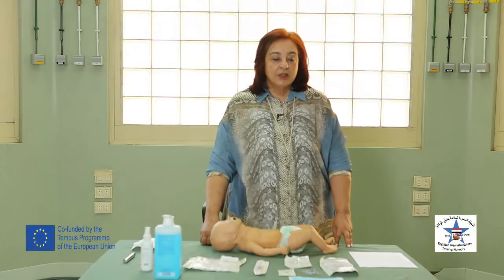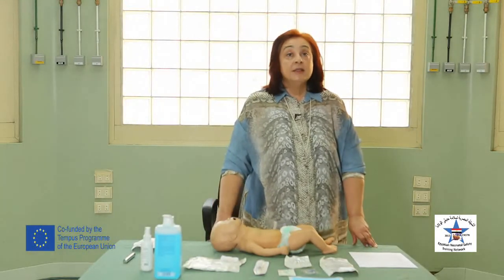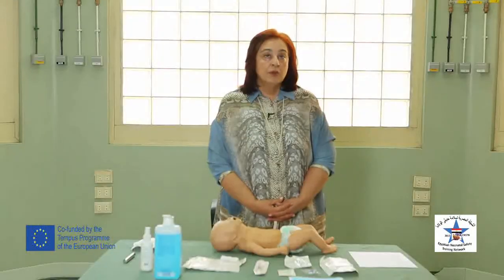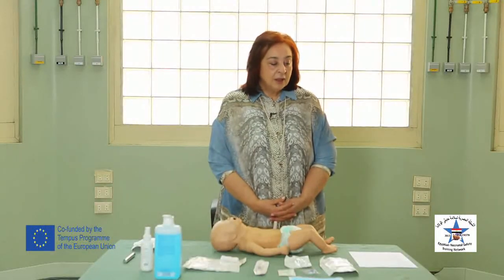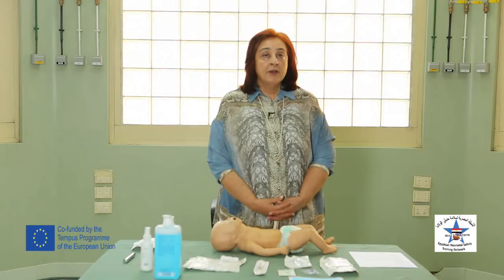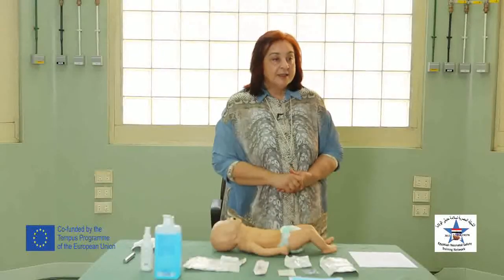Today we will demonstrate the needle aspiration technique for pneumothorax. Pneumothorax is the presence of air in the pleural cavity. It is a serious condition in the newborn which, if extensive, may cause severe progressive respiratory distress with hemodynamic instability which compromises the oxygen saturation in the blood. It's treated in two ways, either to do needle aspiration or to proceed after needle aspiration to chest tube insertion. The indication for needle aspiration is an extensive pneumothorax.